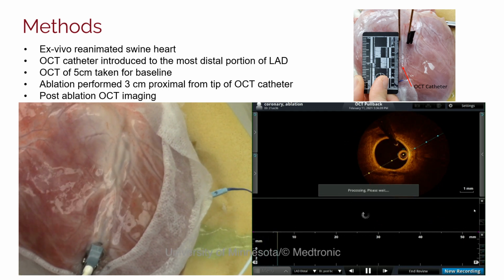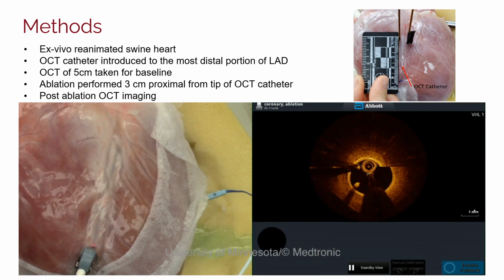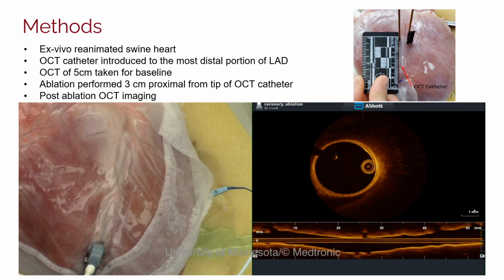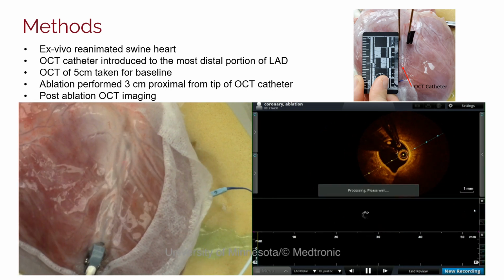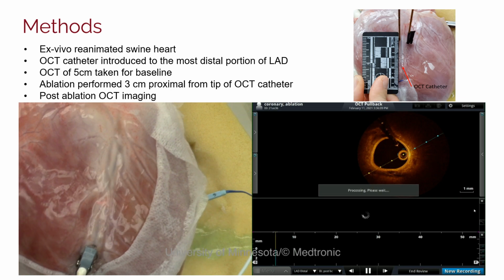IRE ablation needles. After the ablation has been performed, we can actually take a post-ablation OCT, and then we can look at the quantified measurements for our area changes and our diameter changes.